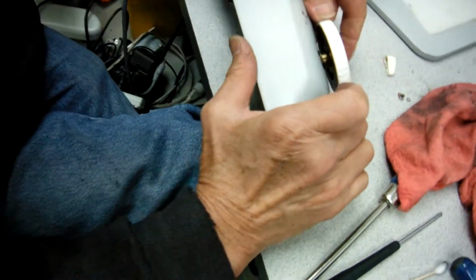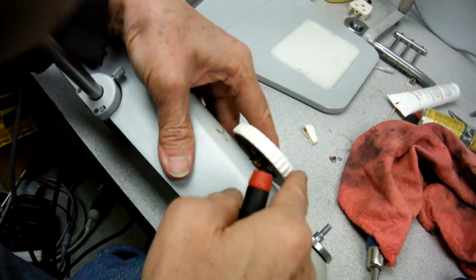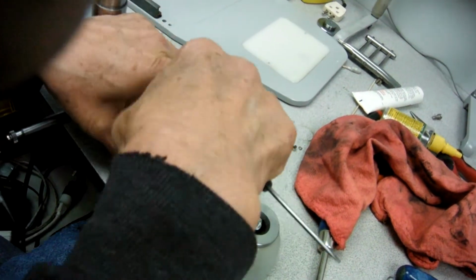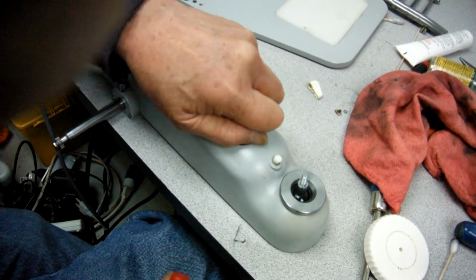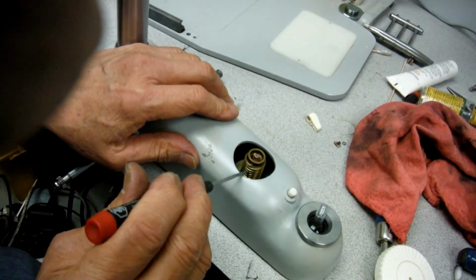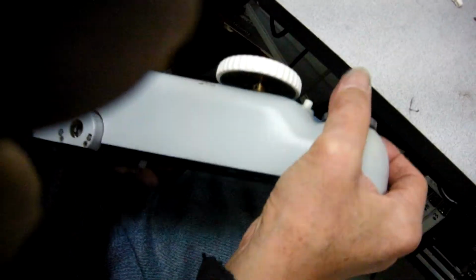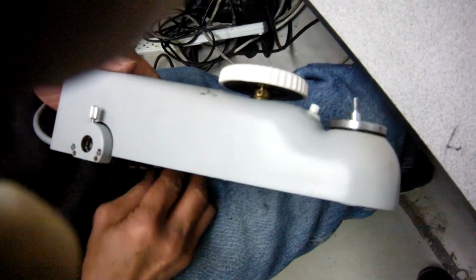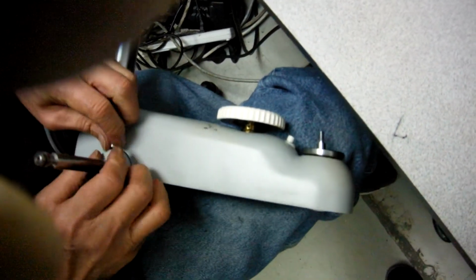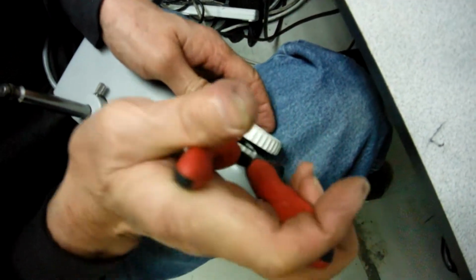Now make sure when you run in there, you see it's not all the way down yet. There's still a gap there. So in order to screw that one all the way to the top, you need to find something to hold this. Either you have a real small pair of pliers, and then you grab the hole on that, and then you can screw this one in there.